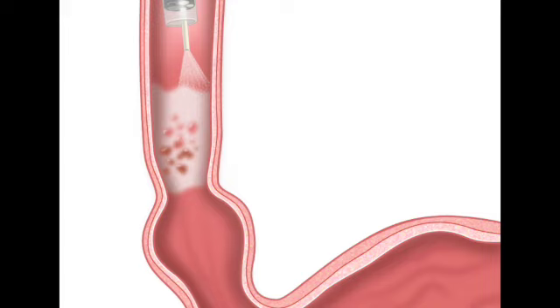Right. But the source material doesn't limit this technique just to the esophagus, right? No, not at all. If we zoom out and move further down the gastrointestinal tract, does this same chemical map perform just as well in massive open spaces like the stomach or on the flat surfaces of the colon? The applications extend beautifully into those areas. Really? Yeah, the underlying principle, using acetic acid to expose chaotic neoplastic cell structures, actually solves completely different geometric problems in the stomach and the colon.